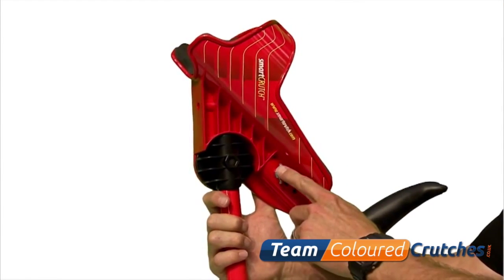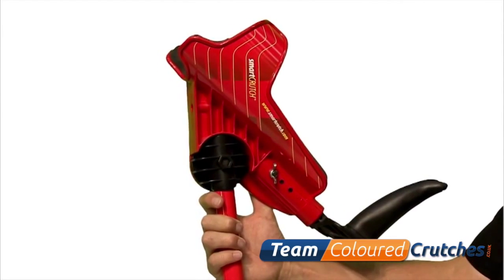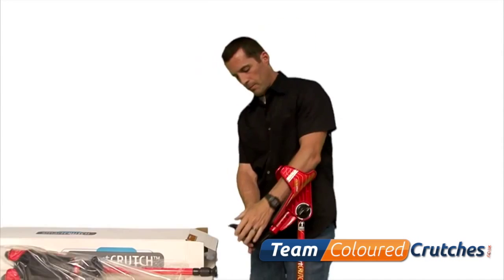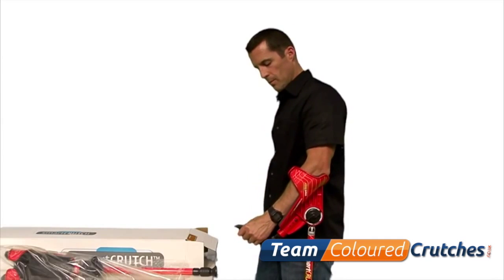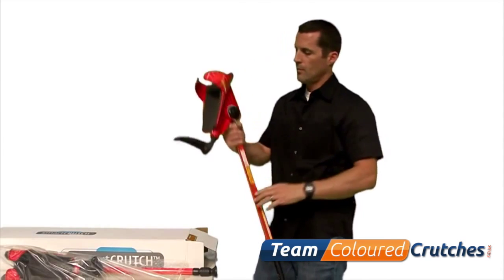Once you have the correct height adjustment, we now need to set the forearm length adjustment. There are three forearm adjustment positions. With your arm through the cuff and your hand comfortably on the grip, check to see that your elbow is in line with the end of the forearm platform.